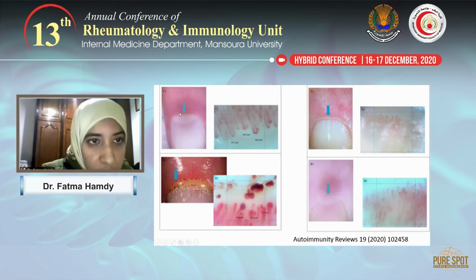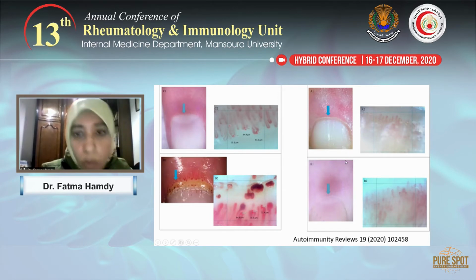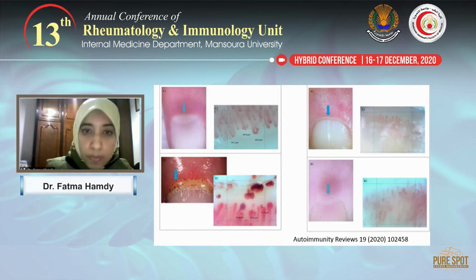In this image, we can see that the giant capillaries are not visible with the dermatoscope. Also, the same applies to the normal capillaroscopic and non-specific changes.